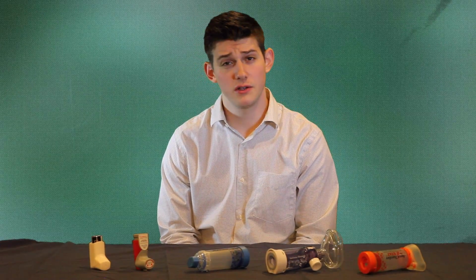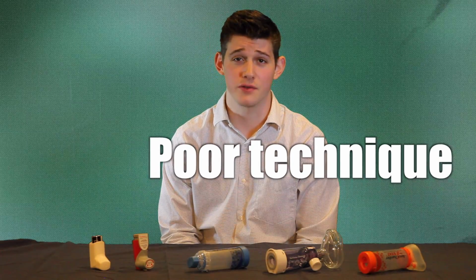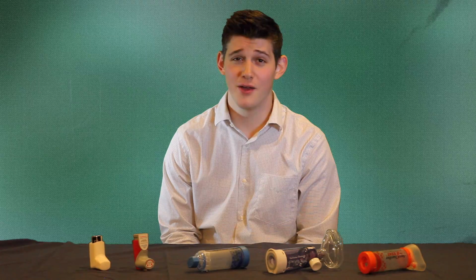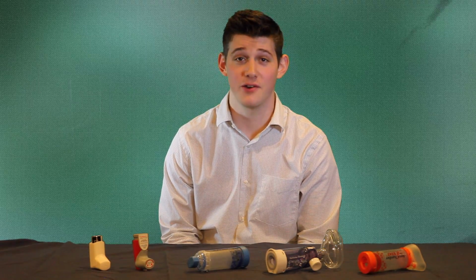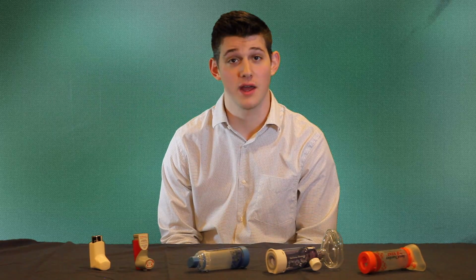Studies have shown that children are not using their inhalers as prescribed, and even when they do use them, they rarely use the proper technique. Furthermore, the rate of incorrect technique among providers has been shown to be as high as 85%, and we do not want you to be part of that group.